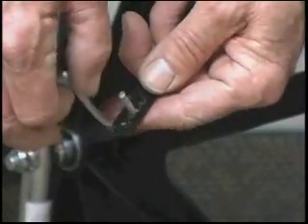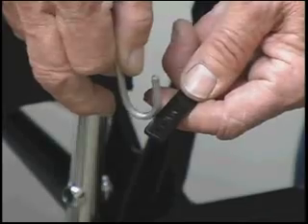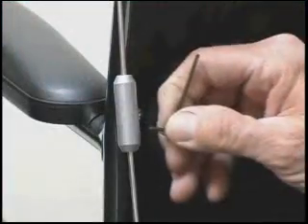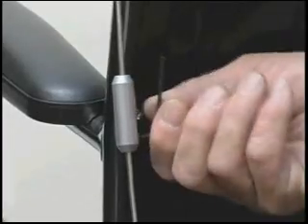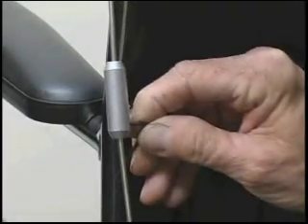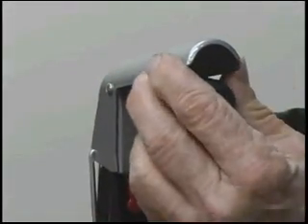Spring tension can be adjusted by choosing the appropriate space on the spring tension adjustment strap. Move down for less tension and up for more tension. Should the palm release lever get out of adjustment due to tire wear, it is easily adjusted by loosening the set screw with a hex wrench, allowing the lever to be reset to the desired height before retightening the set screw.